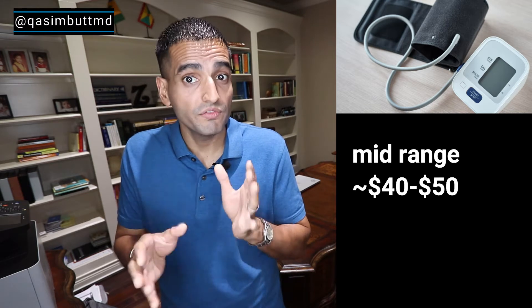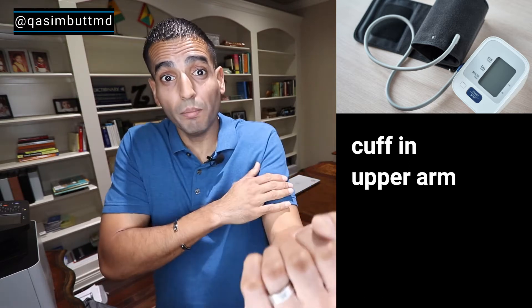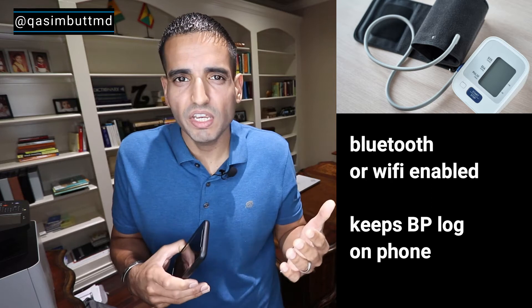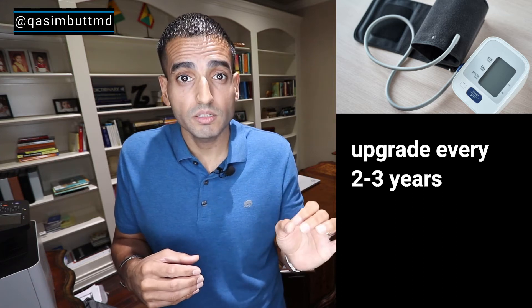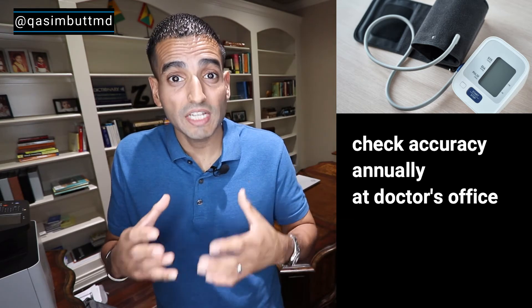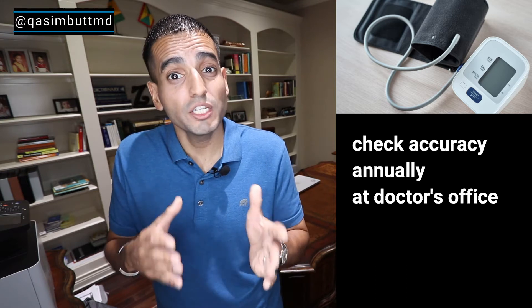What blood pressure monitor to buy. I've seen blood pressure monitors vary in range from anywhere from $20 to over $100. I would opt for the mid-range around $40 to $50 to get decent quality. I prefer the monitors that check blood pressure in the upper arm rather than the wrist — they're closer to the heart so they may get a more accurate reading. If you're tech savvy, I would opt for ones that are Bluetooth or Wi-Fi enabled so they can connect to your phone and record the readings. If you already have one for a few years, you may want to consider getting a new one every two to three years, as these are consumer products and their accuracy can deteriorate. You can bring it to your doctor's office and compare it to their machine, and this should be done on an annual basis.